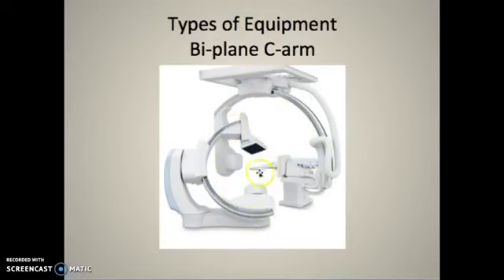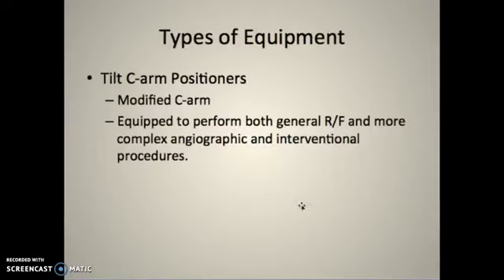You have to be really good at driving these tables. It gets very confusing and you've got to be pretty good. So if you're working at a center that has biplane and you're able to drive these tables nicely, you're going to have a lot of work. It's good. All right.